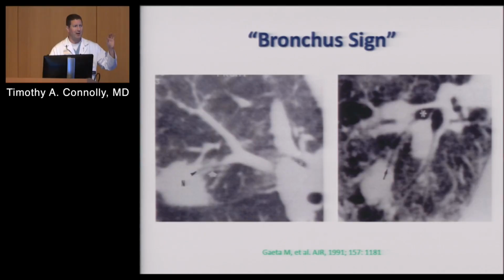And I'll show you images right at the end, where we marry a computer map to the CT scan, and it will direct us almost like a GPS. Go right, go left, go up, go down. And we can get to that basic vicinity, as opposed to if we did it old school, where we'd know it's in the upper lobe, we go into the upper lobe, and then just start blindly trying to find an airway that takes us there. The yield for doing it the old traditional way was about 30%. If we have this, the yield can be up to 80%.